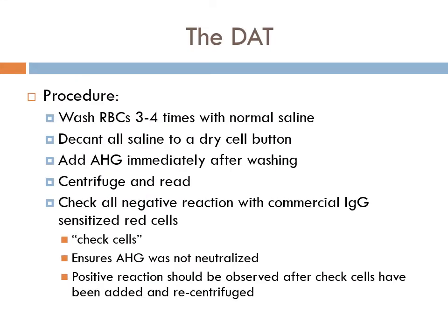So how do we perform this DAT? It's a really simple procedure that a lot of times, especially in clinical situations, someone says, hey, do a DAT on here. And because a lot of blood bank procedures are complicated or complex, this messes people up. It's a very straightforward procedure.